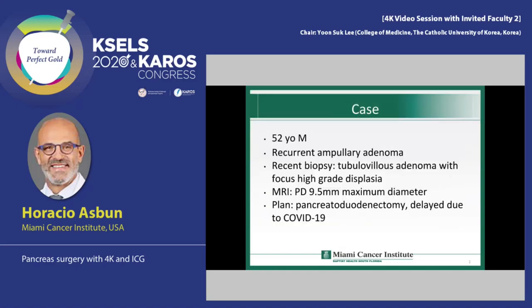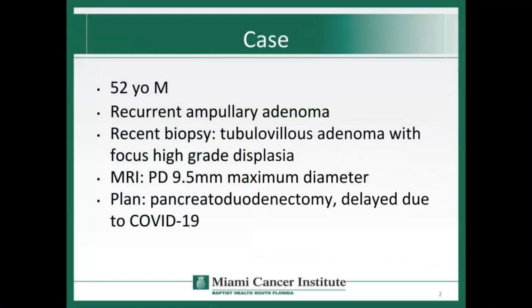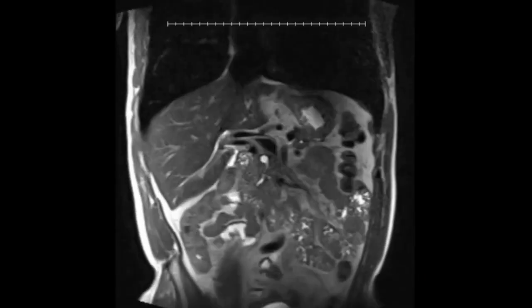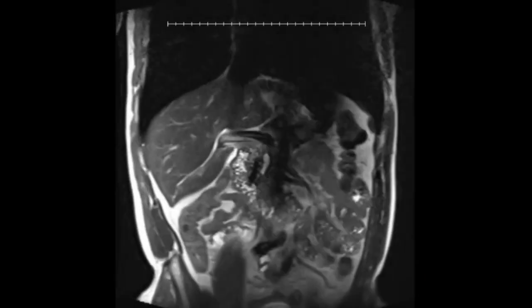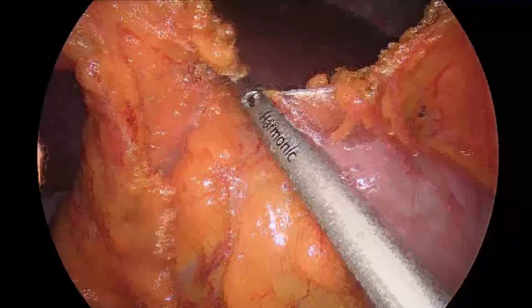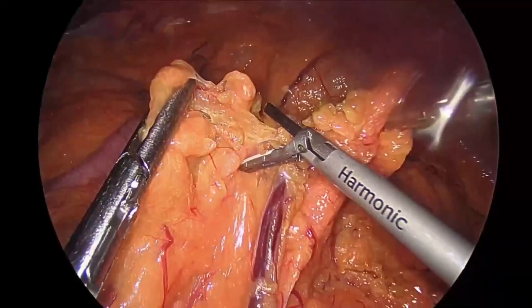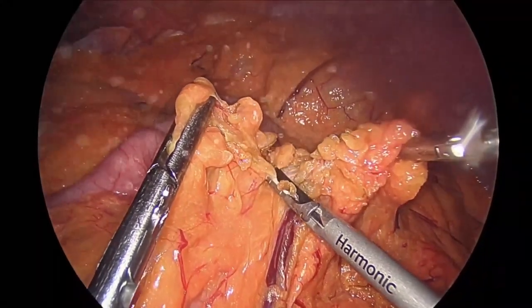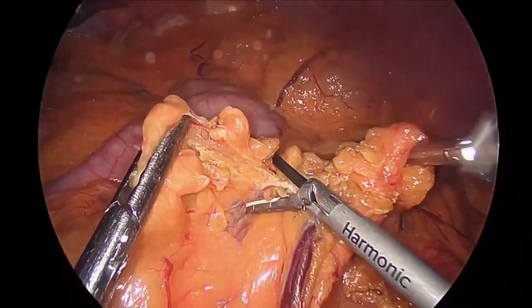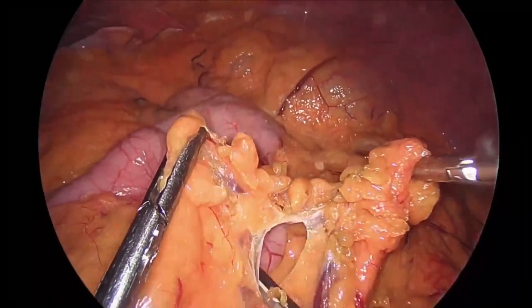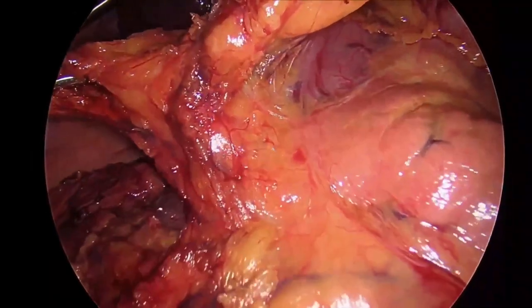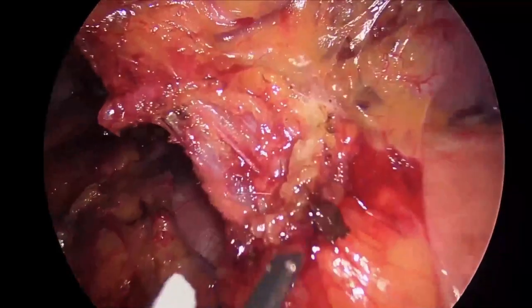The patient is a 52-year-old male with a history of a recurrent ampullary adenoma. He had undergone an endoscopic mucosal resection and now presented with a recurrent lesion and high-grade dysplasia on biopsy. An MRI of the abdomen demonstrates dilatation of the pancreatic and biliary ducts. The procedure is started by splitting the omentum longitudinally for the future postpyloric duodenojejunostomy. Then the lesser sac is entered and the gastrocolic omentum is divided from left to right up to the area of the trunk of Henle.